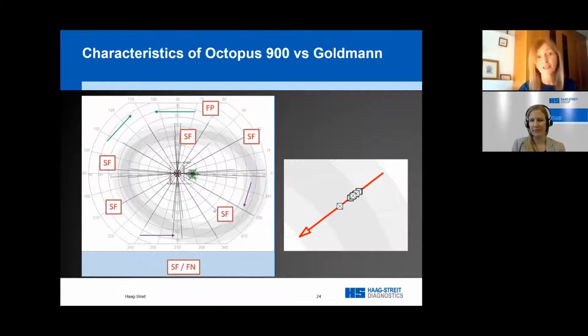Some patients say that they find it more reassuring that you're beside them rather than behind. I think when you set the position of the vectors, it gives you time to watch the patient as well when the test is running, and you're watching for the response before you then set the next vector. So the whole thing flows quite well.